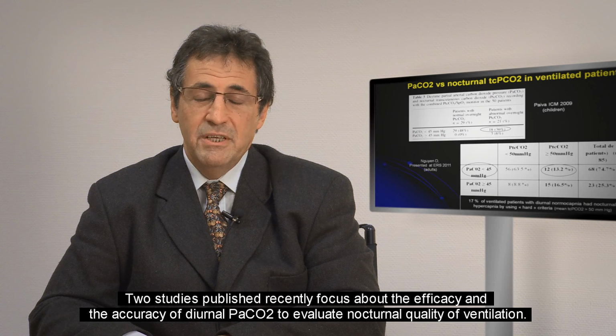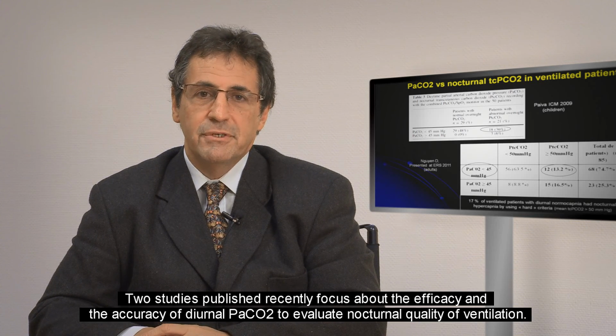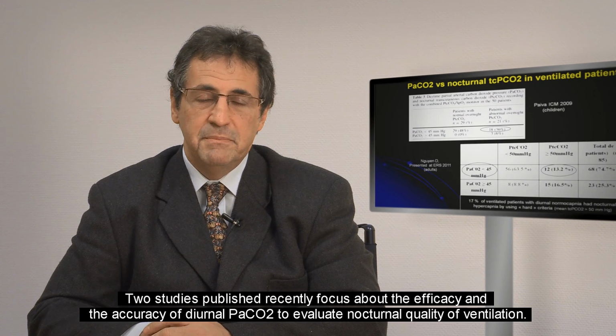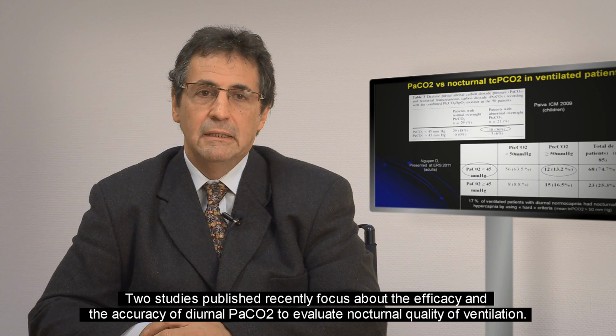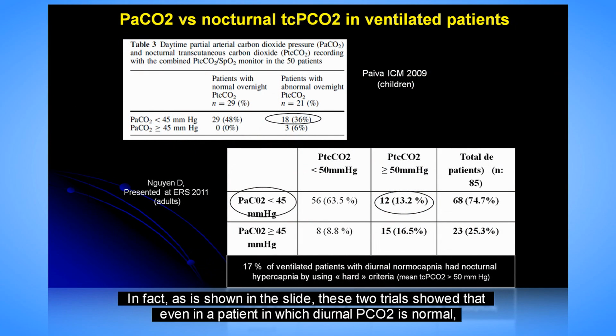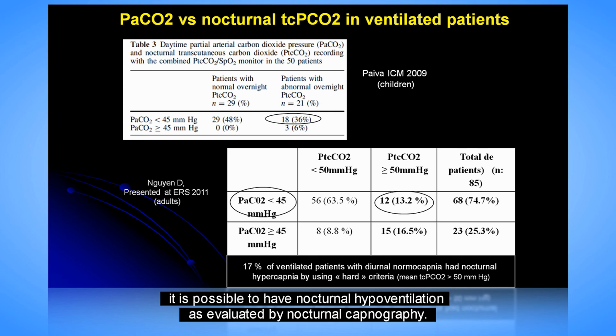Two studies published recently focus on the accuracy of diurnal PCO2 to evaluate nocturnal quality of ventilation. And in fact, as is shown in this slide, these two trials show that even in a patient in whom diurnal PCO2 is normal, it is possible to have nocturnal hypoventilation as evaluated by nocturnal capnography.